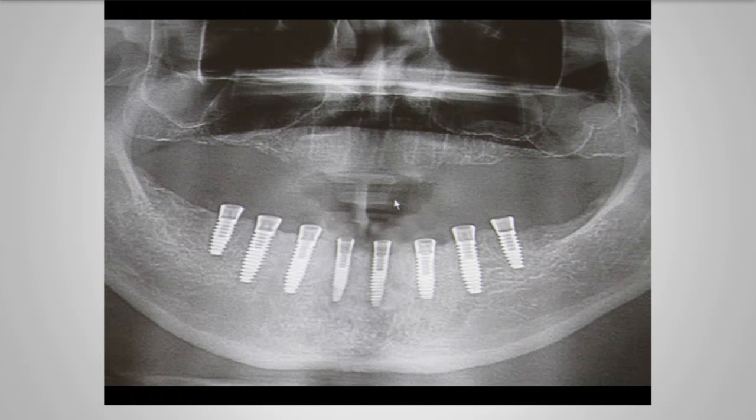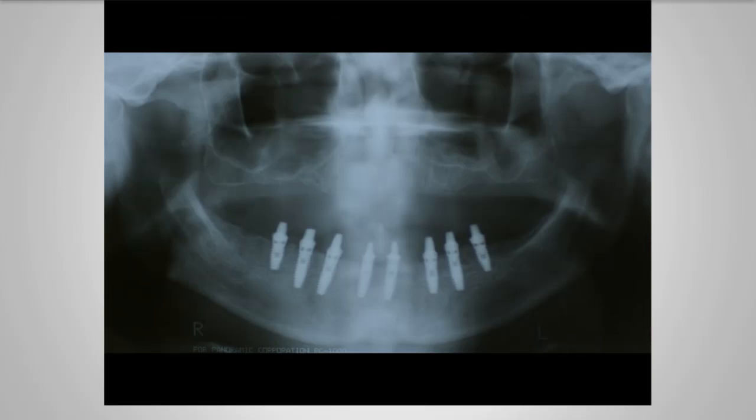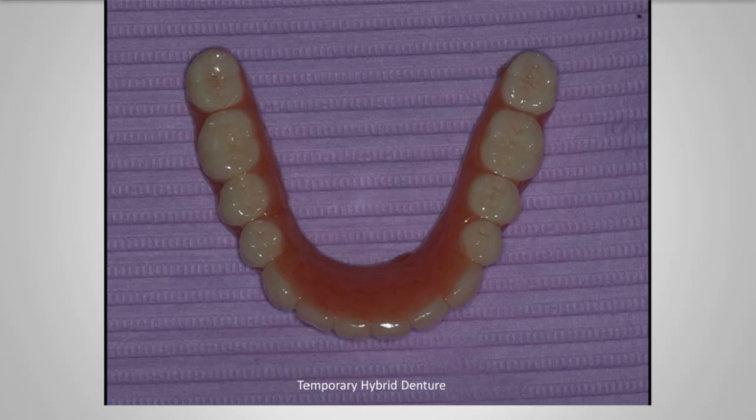Here we have a universal surgical guide just to show you that we have used a variety of different guides that are out there. In this guide, we use a variety of different size sleeves or keys and sequentially go to larger size drills. Once the implants were placed, we took an x-ray and we saw that all the implants look nice.